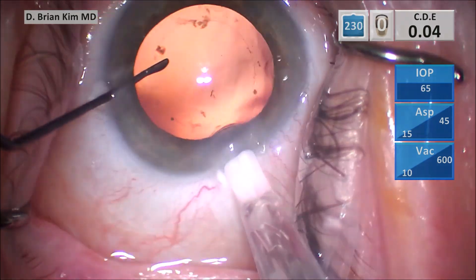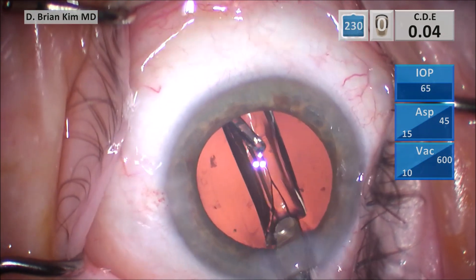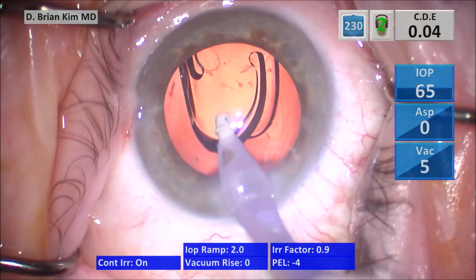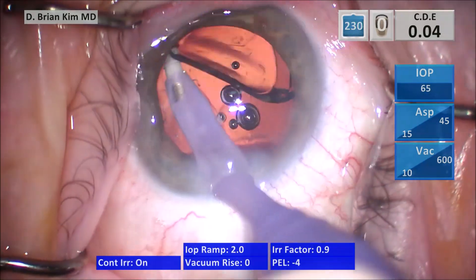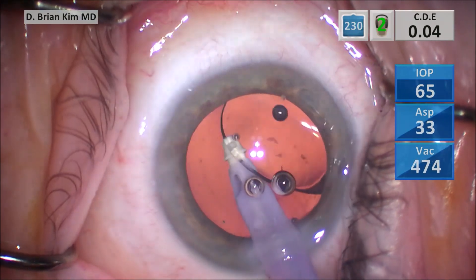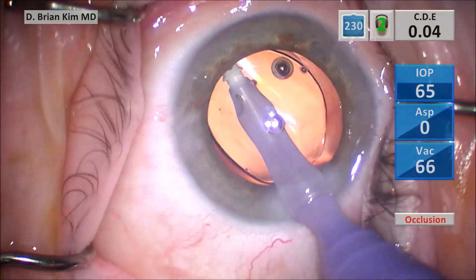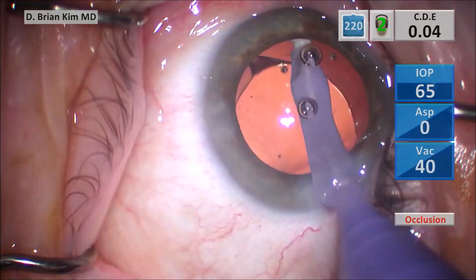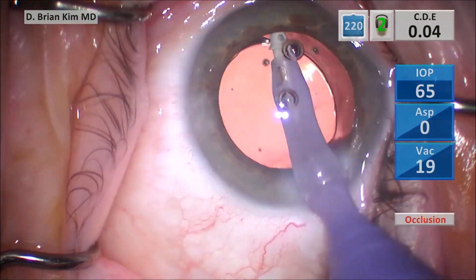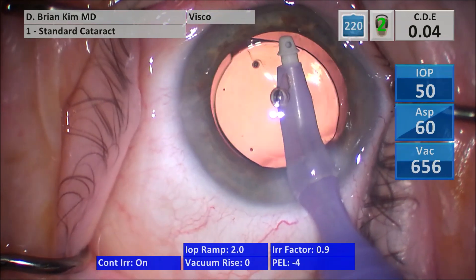I'm using the sweep to sweep underneath the rexus edge for any more lens epithelial cells. Once I feel it's clean, I go ahead and inject the single-piece acrylic intraocular lens into the capsular bag, placing the leading edge within the bag and the trailing edge out of the bag. I go in and inflate the bag with irrigation, make sure the haptics are off the optic, go under the optic, tilt it and rotate it 90 degrees, removing all the viscoelastic from within the bag. I polish underneath the rexus edge to remove any more lens epithelial cells, which already turned the haptics horizontally, so I switch to the visco mode, removing all the viscoelastic from the anterior chamber.